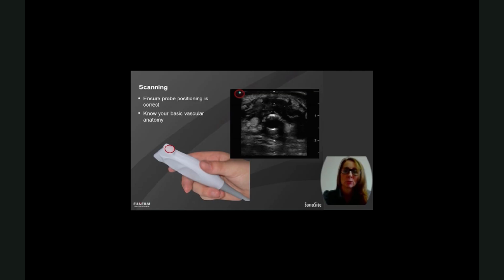This is particularly important when you're using it to do cannulation, because if you're inserting the needle and it's slightly crooked and you want to straighten it, if you've got it the wrong way round, you'll be trying to move your needle to the right and it'll actually be going to the left on you.